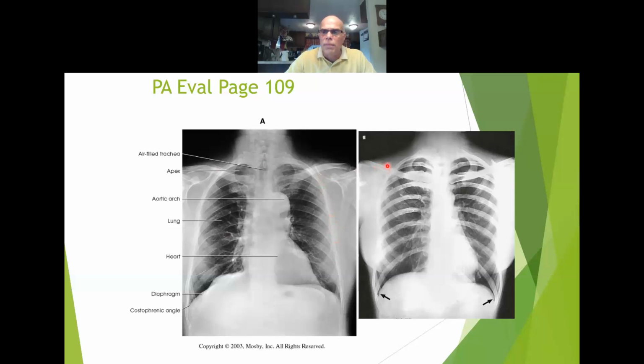Again, you can see the top, the scapular spine right there. I don't see it really superimposing this one. I do see a problem here. This was the one you looked at on that last video. It was the breast issue overcoming the costophrenic angles, but with the breast in place and they're lifted and separated, you can get these costophrenic angles cleared.